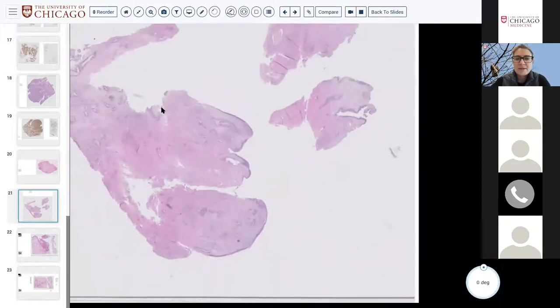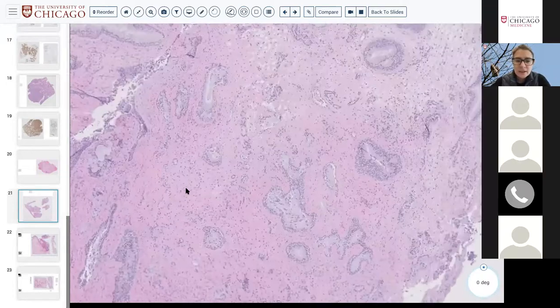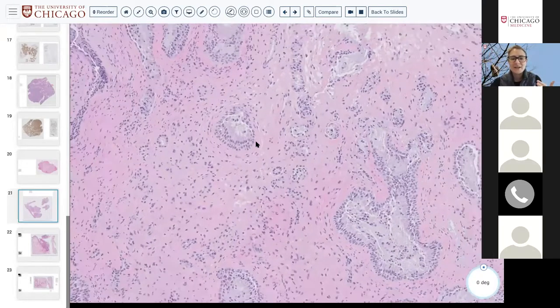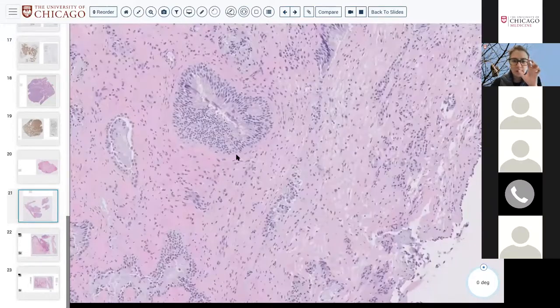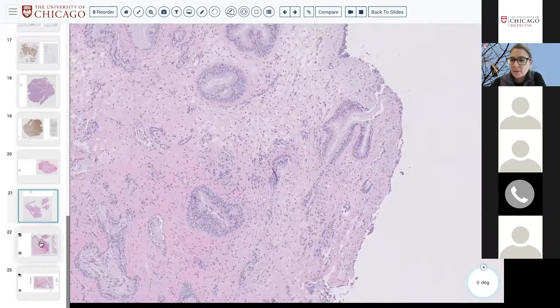So it's different, arguably, from a sinonasal inflammatory polyp because the inflammation in the stroma is very, very minimal, right? In an inflammatory polyp, you'd expect a lot of stromal edema, a lot of stromal inflammation, and perhaps not quite as marked a respiratory glandular proliferation, whether it be the large columnar glands or the small microacinar glands, okay? All right, excellent. Comments or questions on that one?